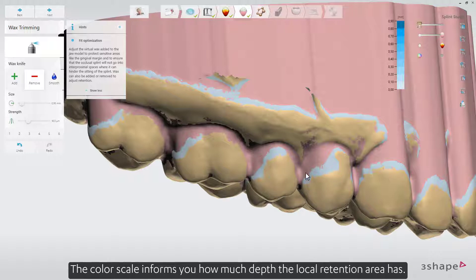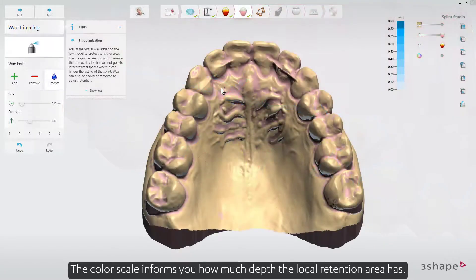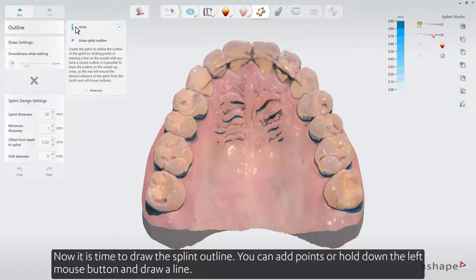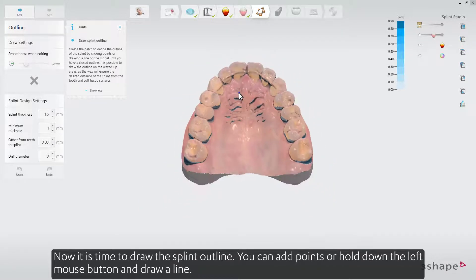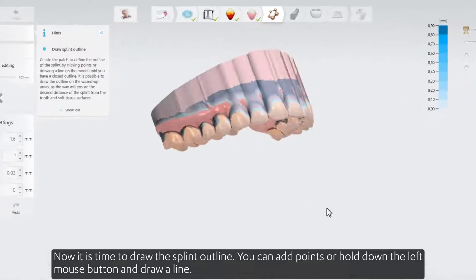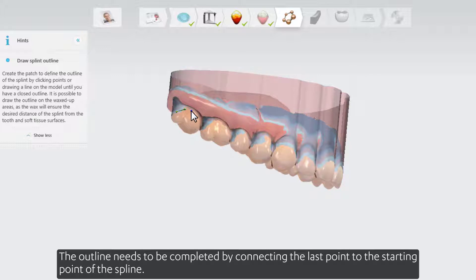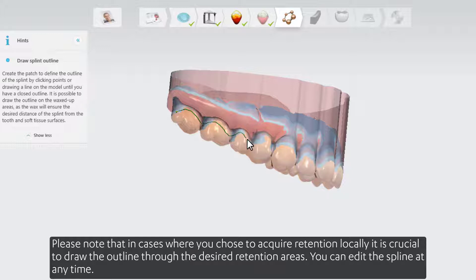The color scale informs you how much depth the local retention area has. When satisfied, press Next to go further. Now it is time to draw the splint outline. You can add points or hold down the left mouse button and draw a line. You can start your outline in various places, for example starting from the last molar. The outline needs to be completed by connecting the last point to the starting point of the splint. Please note that in cases where you chose to acquire retention locally, it is crucial to draw the outline through the desired retention areas.